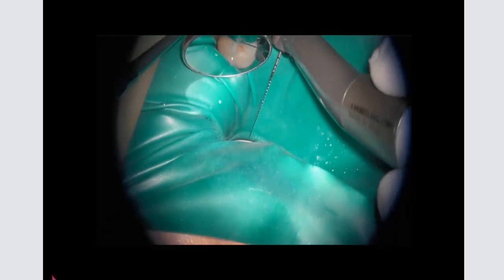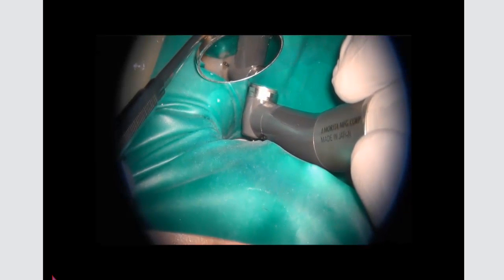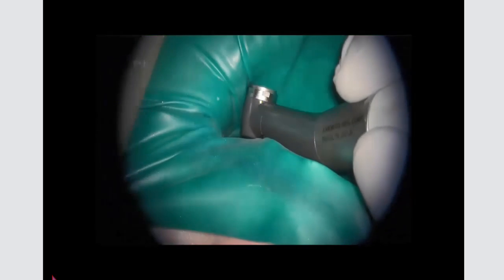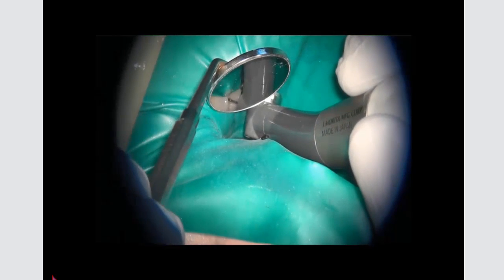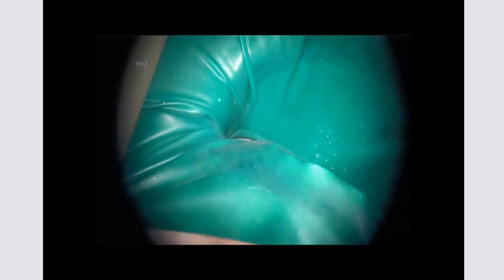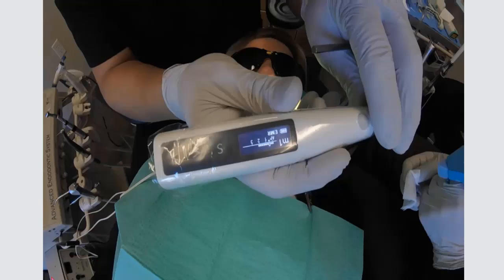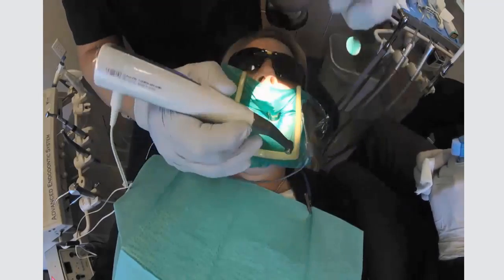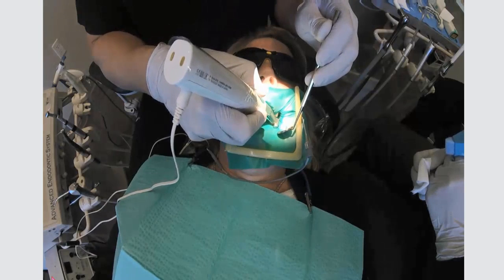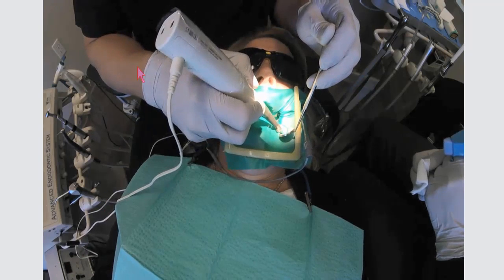So at this point, this is when working length is established. Here I'm using this in an automatic mode. I'm advancing the file down. I'm looking at the display, and I'm making sure that I'm where I want to be. I'm not using rubber stoppers because I'm looking at the microscope, and this is once again the mode from the top, looking at the display. I'm using the markings on the files to determine length based on a reference point on the crown.